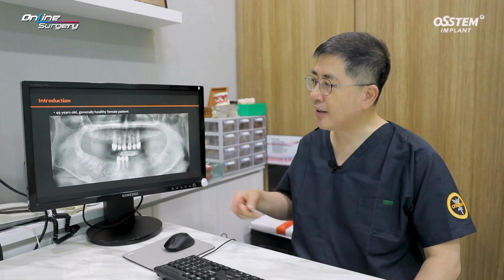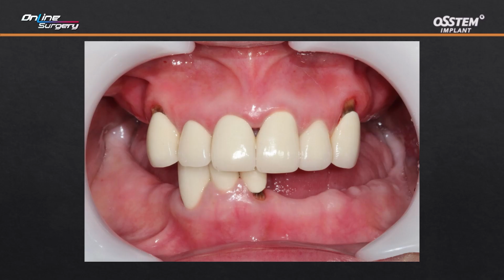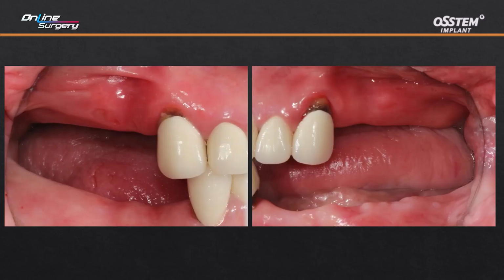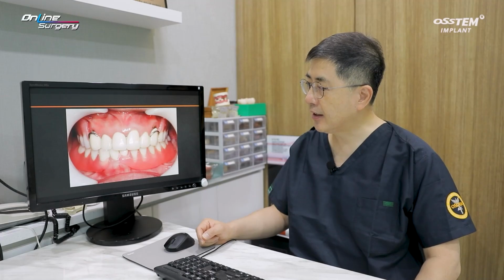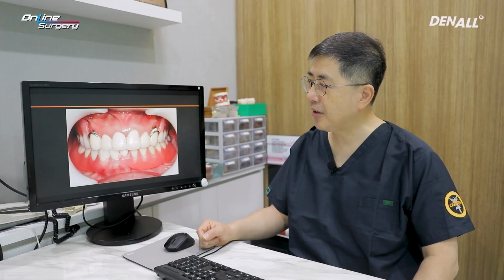Let me explain about this case. The patient was fairly young but lost a lot of teeth. The plan was to use 6 implants in the upper and to provide prosthesis up to the posterior area. This is an initial visit. The anterior 6 is made of porcelain, and you can see that in both posterior areas there are no teeth, and there are only 3 residual teeth in the lower. Wire clasp RPD was used temporarily, and in the lower, the patient was using flexible partial denture.